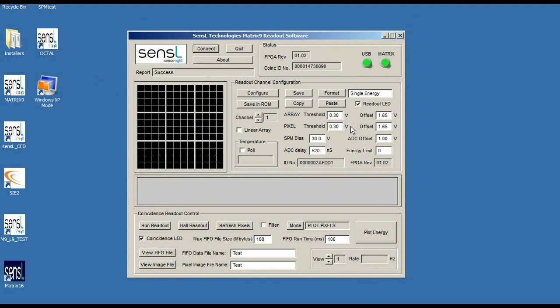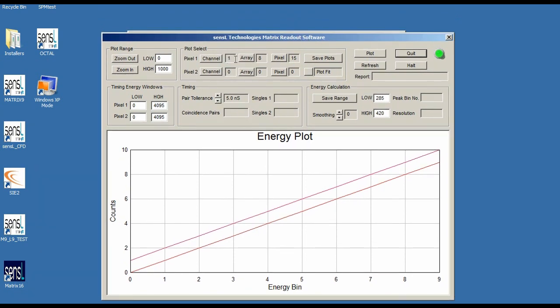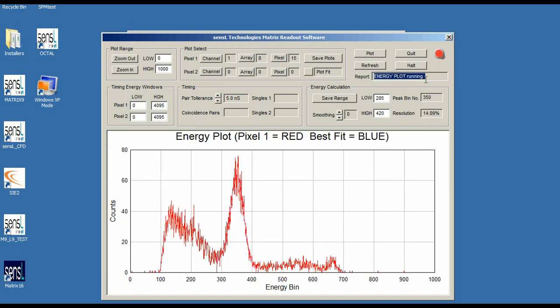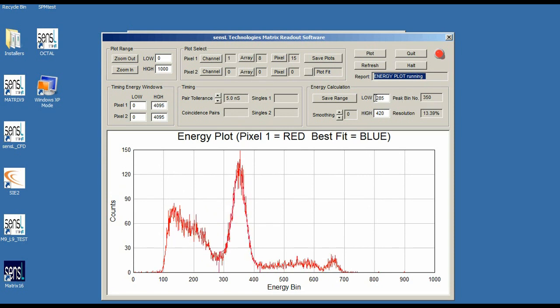We're connected to channel 1. We're going to run the readout just to give us an idea of the pixel number — that's array 8, pixel 15, because it starts at 0. I'm going to halt the readout and go into the plot energy screen for channel 1, array 8, pixel 15, which we've previously set up.